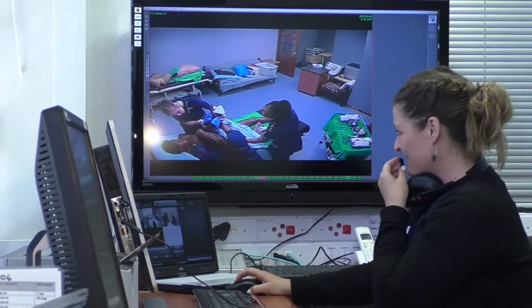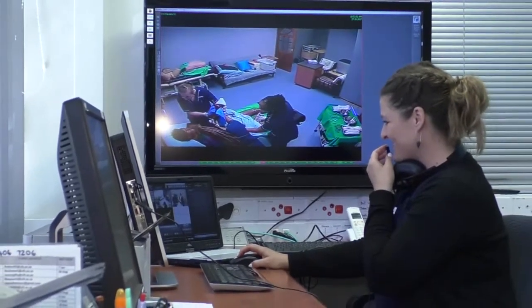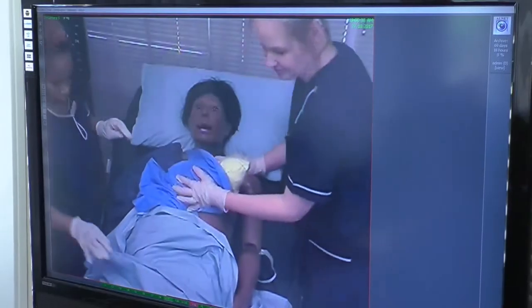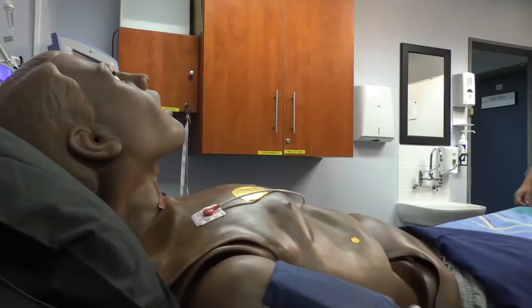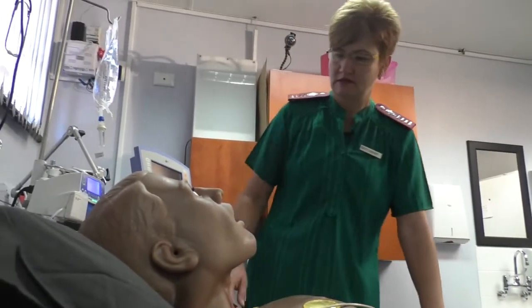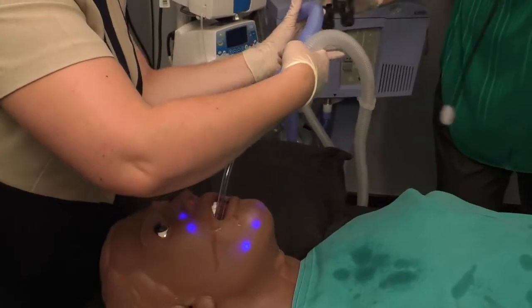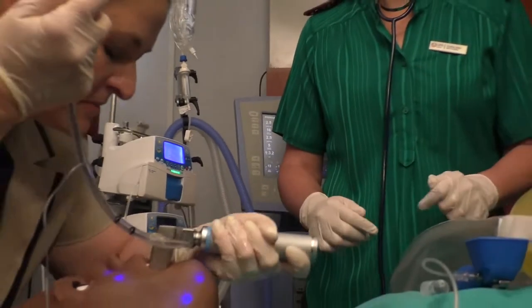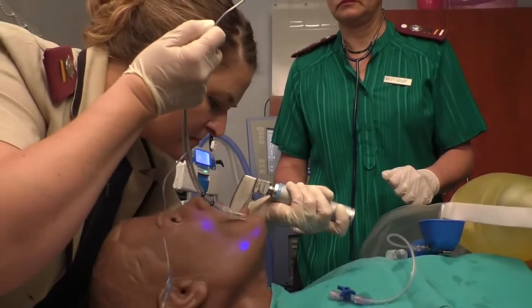Through voice streaming, an operator can communicate with the student and react to student interventions. We can also practice invasive procedures such as intravenous line placement, catheterization, and endotracheal intubation.